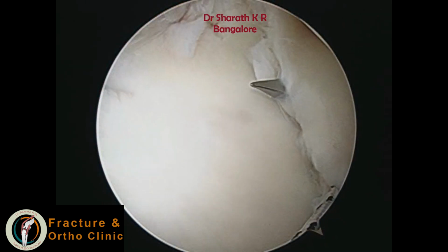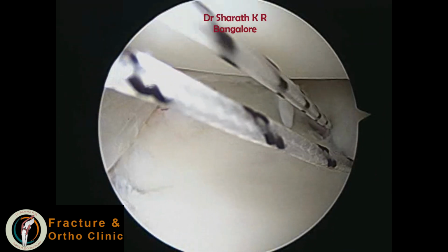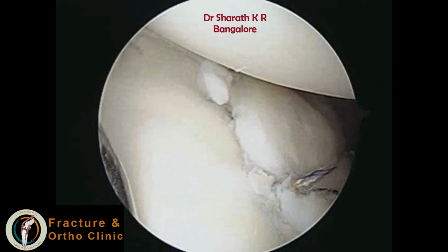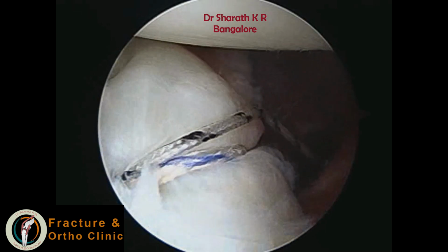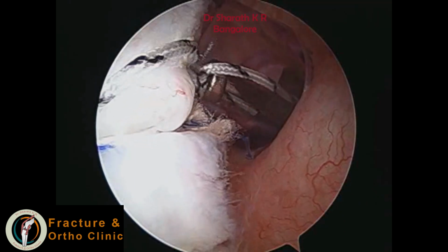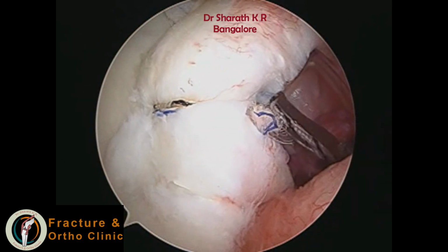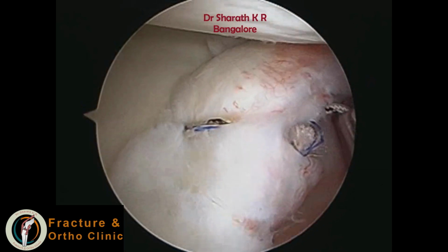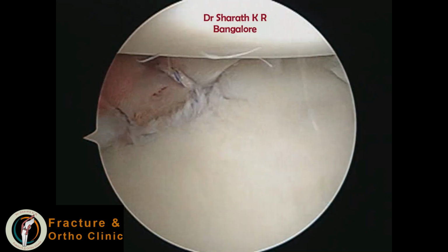To take the anterior limb of the tiger wire, we use the suture push manipulator, so that one of the limbs of the tiger wire is in front and one is behind. Now we make the sliding knot. This completes the posterior labrum repair and anterior labrum repair, and also the evacuation or removal of the fluid from the anterior inferior paralabral cyst.